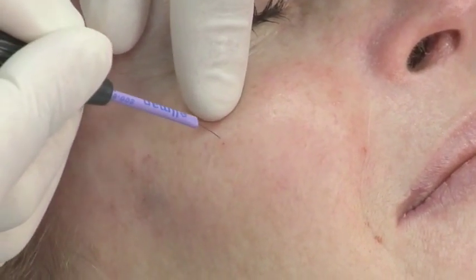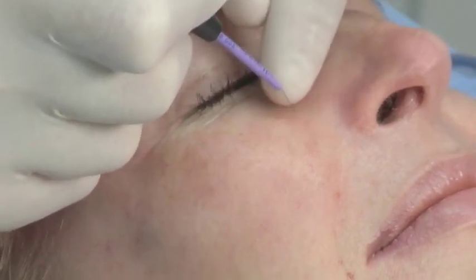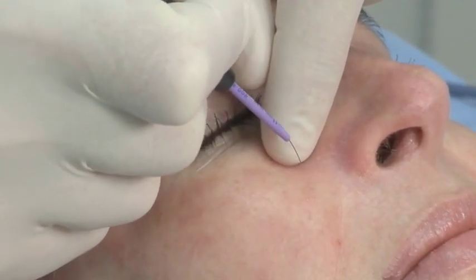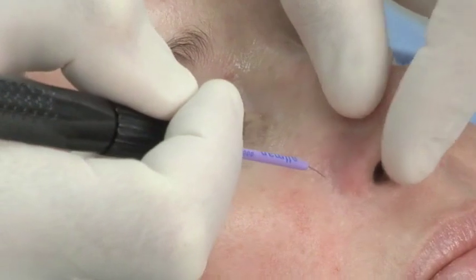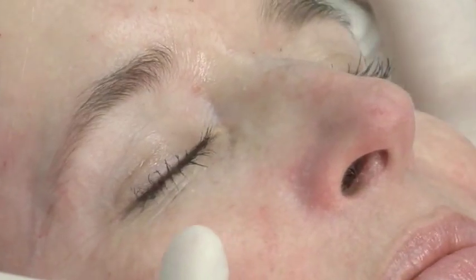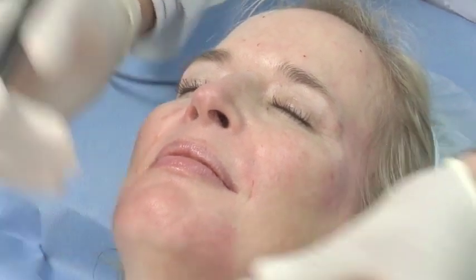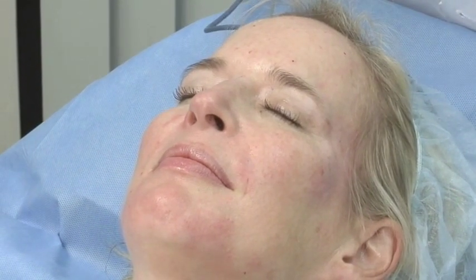You can even break out and come a little further along the sides. You can see there's a very, very fine wire that I'm using. Very quick and easy — nice use of this technology. Robin's had some filler and neurotoxin today, but it also illustrates that this is a nice little quick add-on procedure that you can do in combination with other things such as fillers and neurotoxins all in the same sitting.